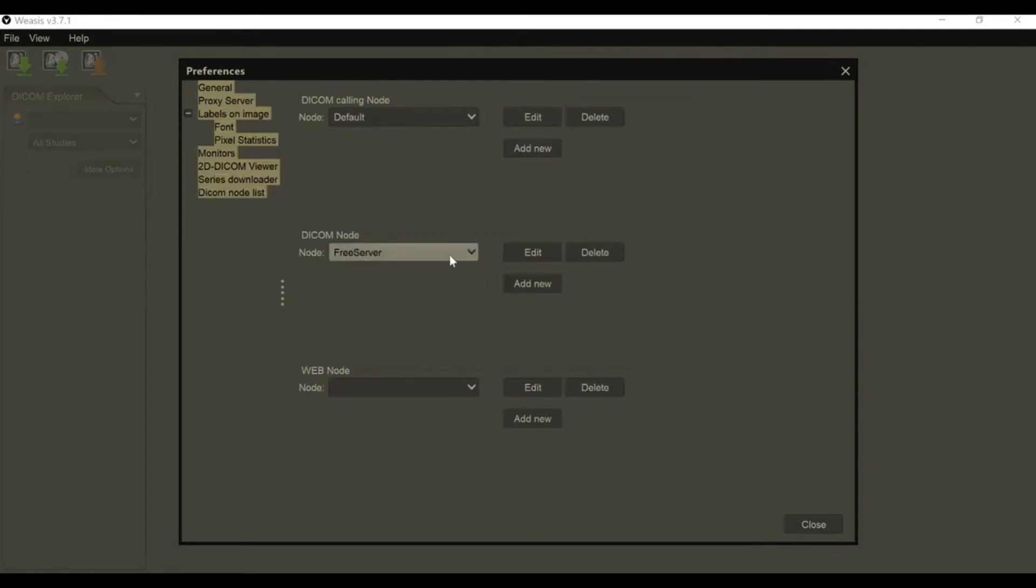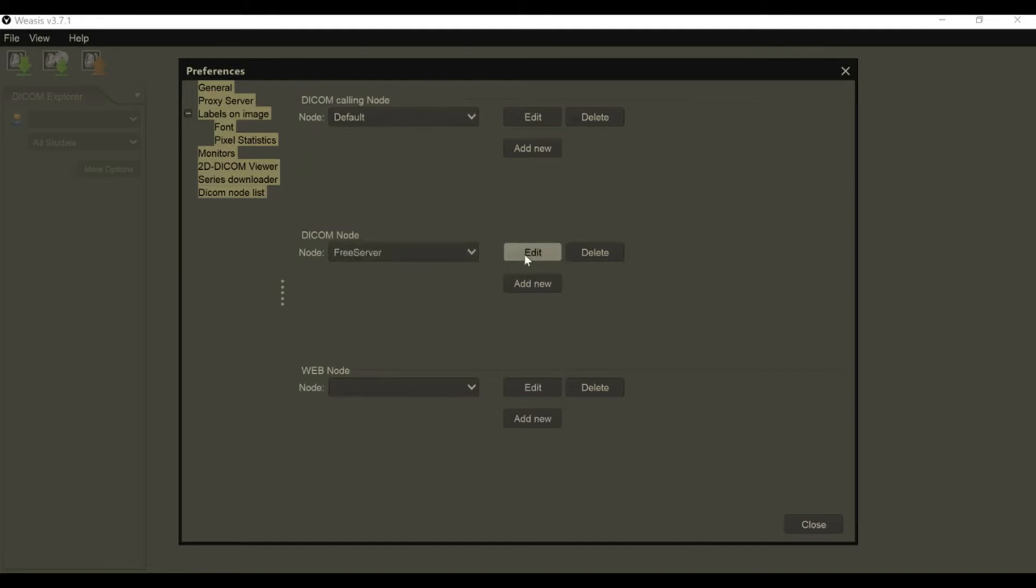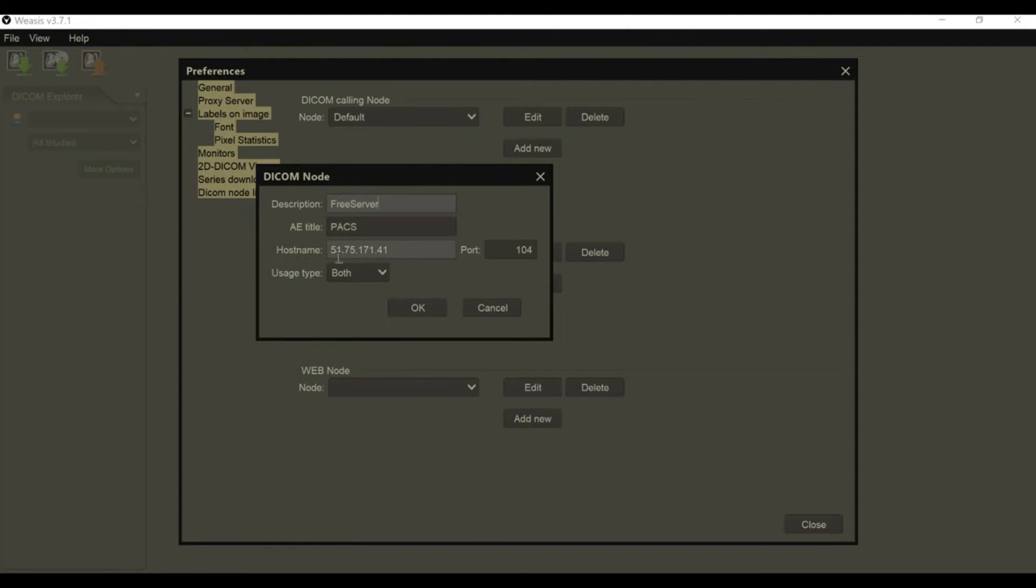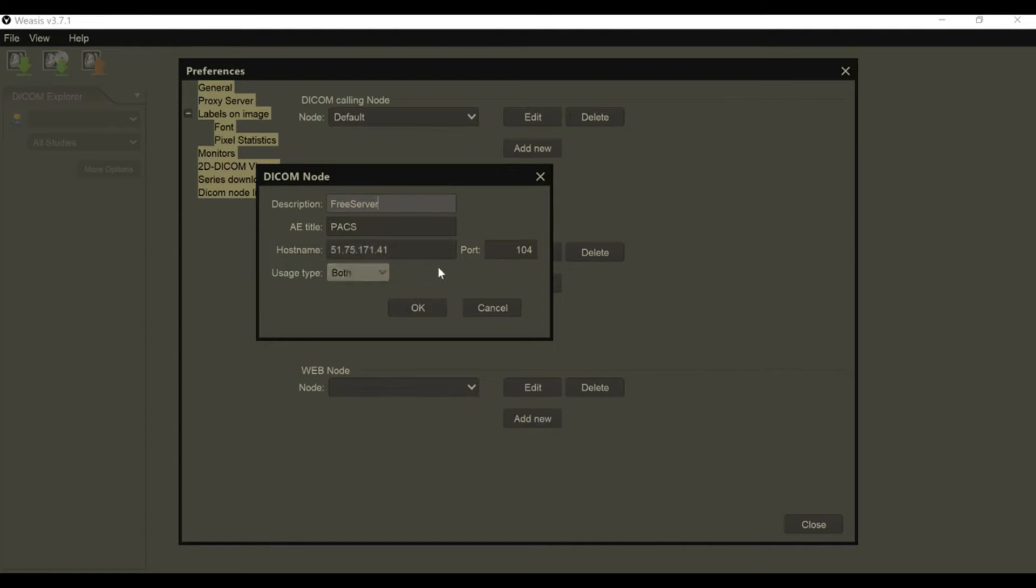I have one already configured here, this is our free server. Your description is going to be free server. The AETitle is not that important, it can be packs or free packs. Your hostname is going to be 51.75.171.41, and you're going to have your usage type as both. Your port is going to be 104.